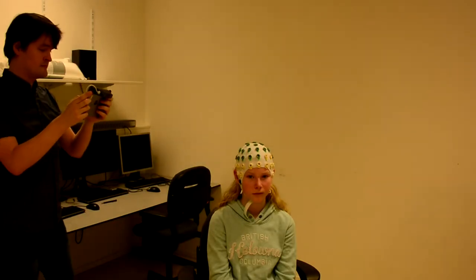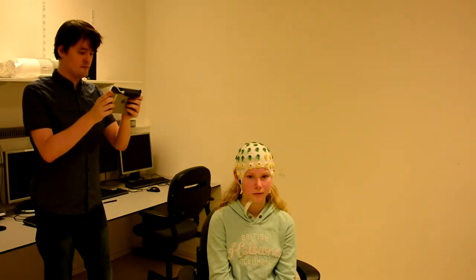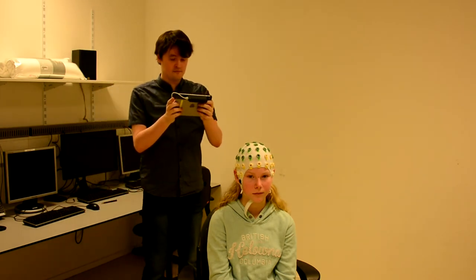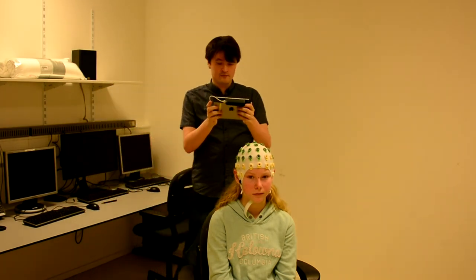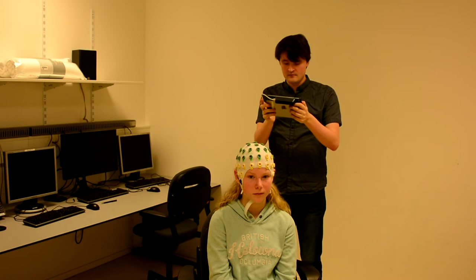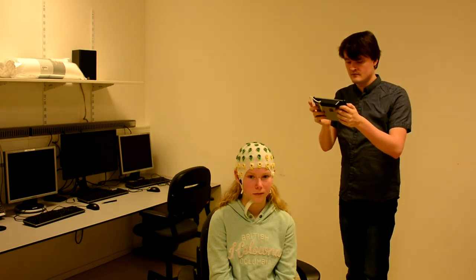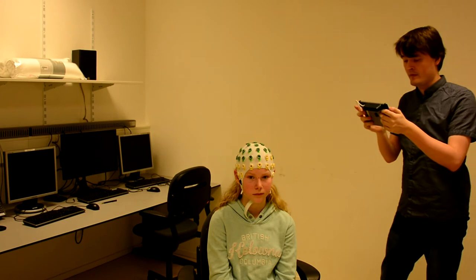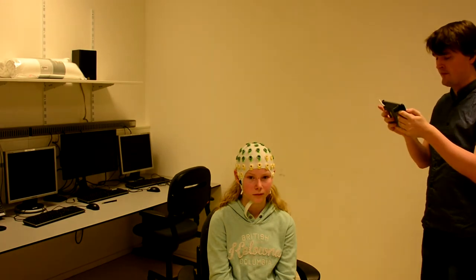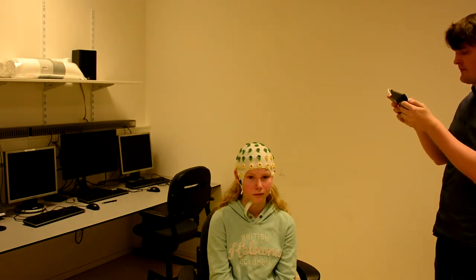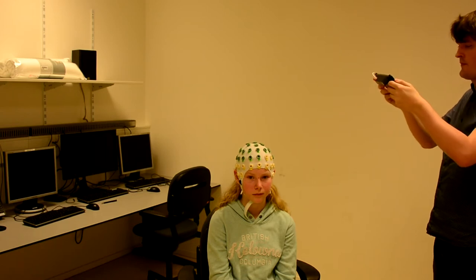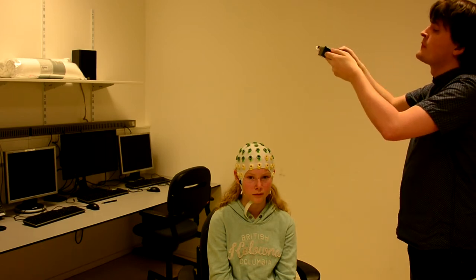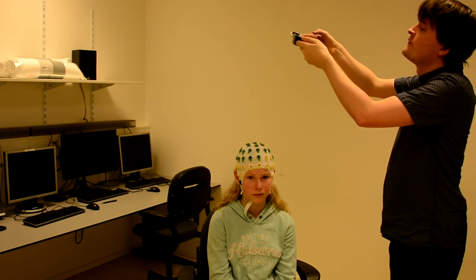The distance between me and the subject is roughly one meter. We can slowly walk around the subject and measure it. You can see me in between. I'm stopping. This time the device takes a picture frame for the coloring. After roughly 180 degrees around the subject, I start to lift the iPad above the subject to also measure the upper part of the cap.